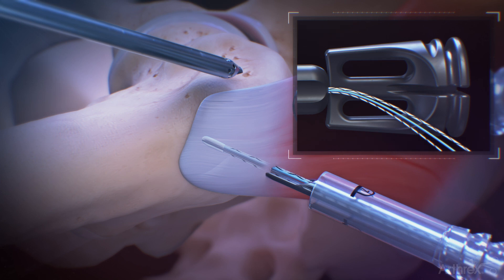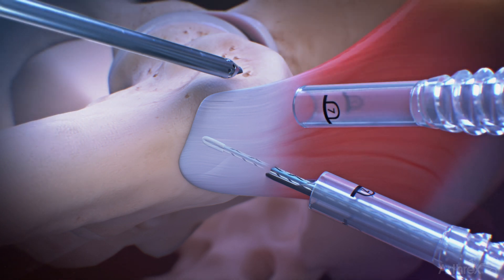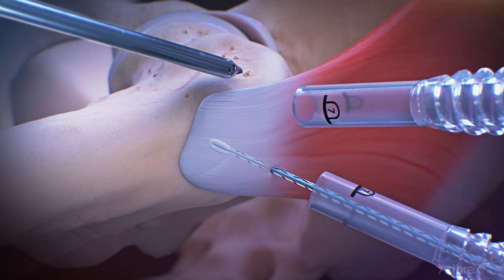Pull the black suture release tab and remove the inserter and drill guide. Set the anchor by slowly pulling all three strands of suture. Repeat the same process through the anterior lateral portal to insert the anterior anchor.